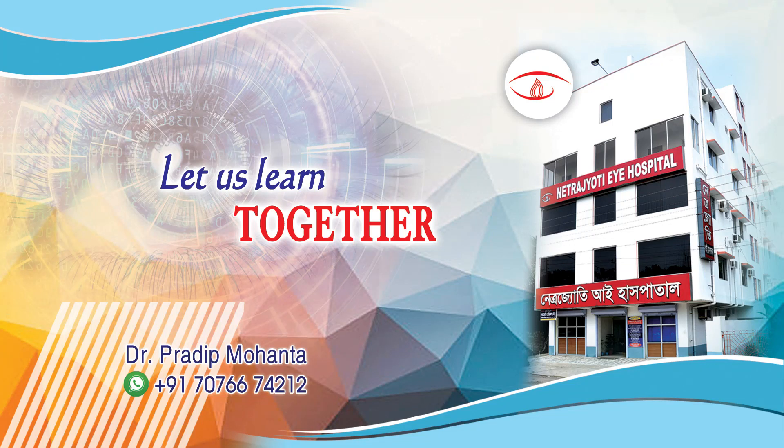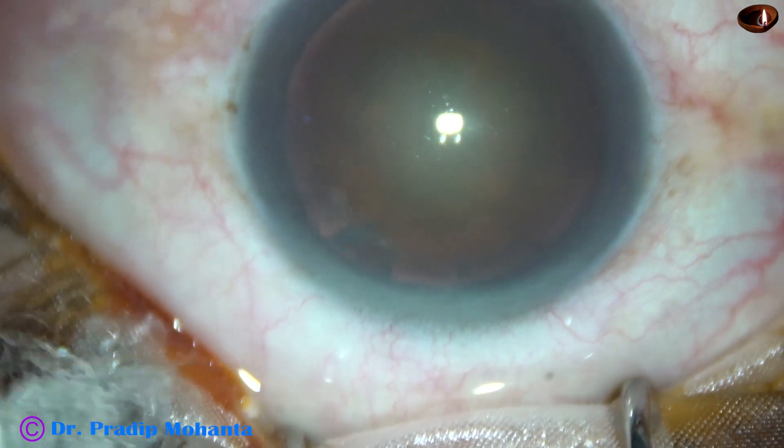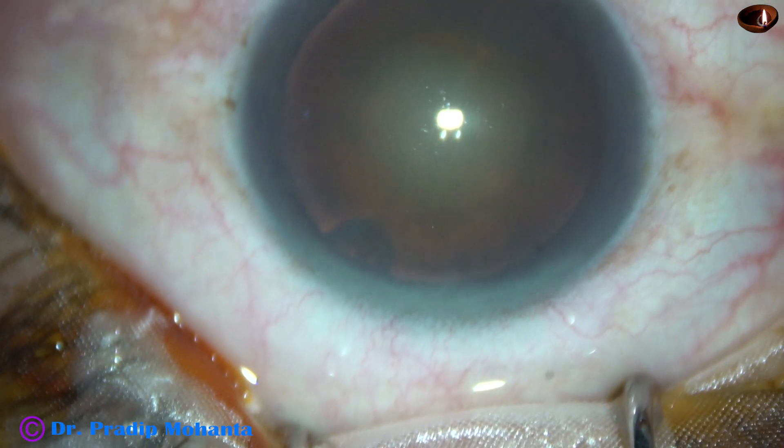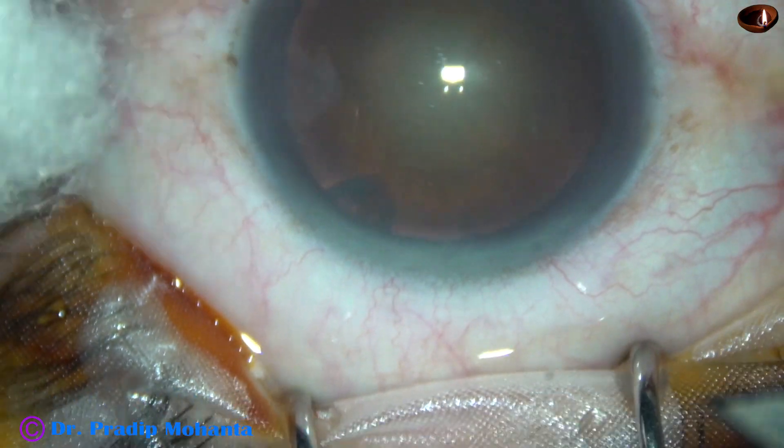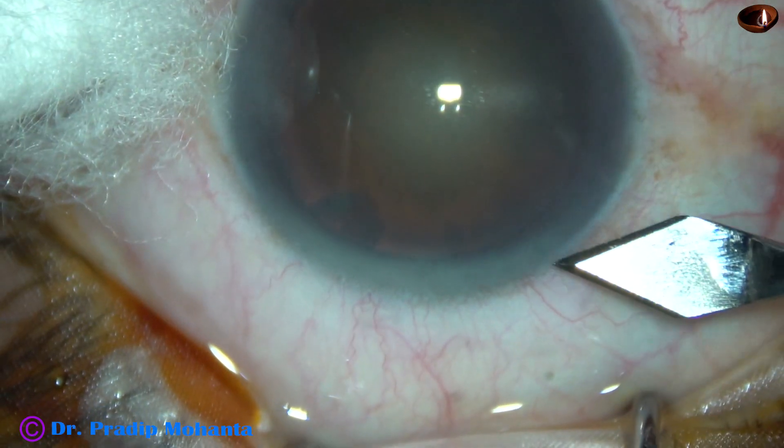Friends, welcome to my workplace at Ranaghat, West Bengal, India. Let us observe this totally unedited FECO. This is a posterior subcapsular cataract with grade 3 nuclear sclerosis.